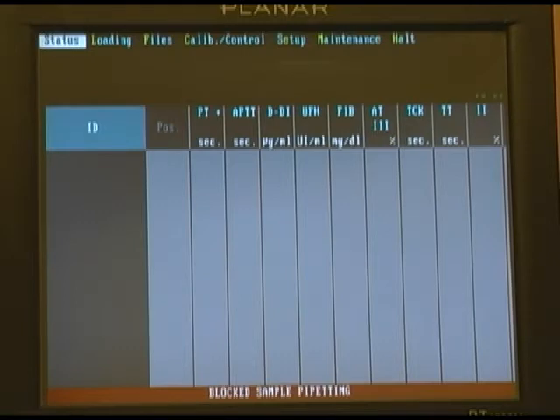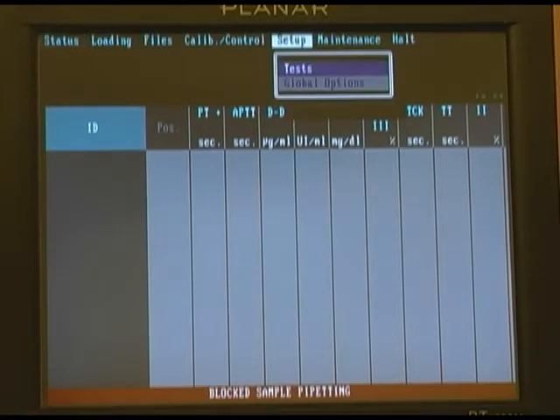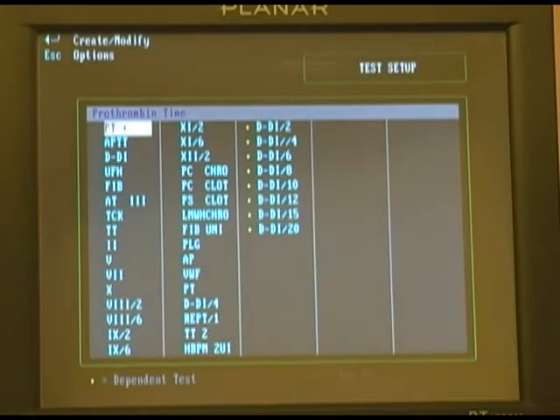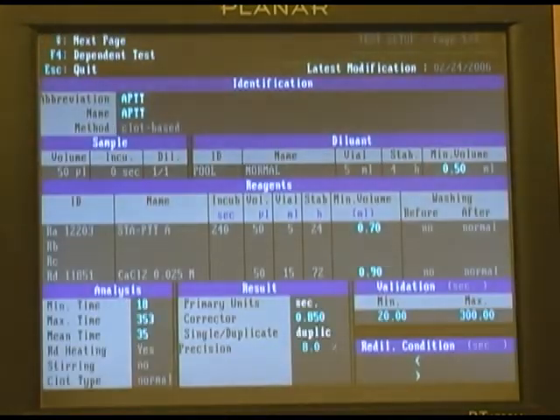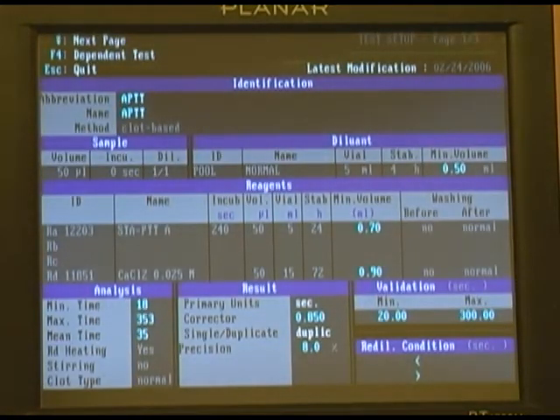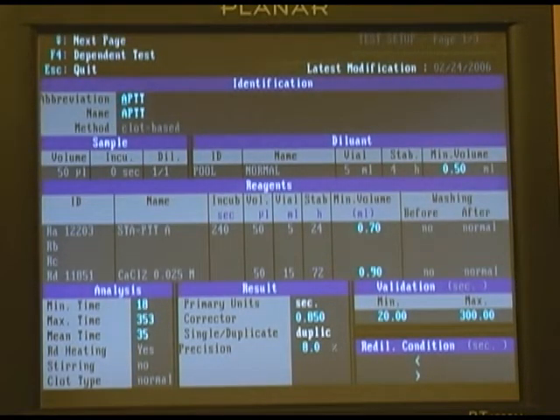We're going to go back to our test setup and select a test. In this case we'll select our PTT. This will identify how the test is set up and configured.